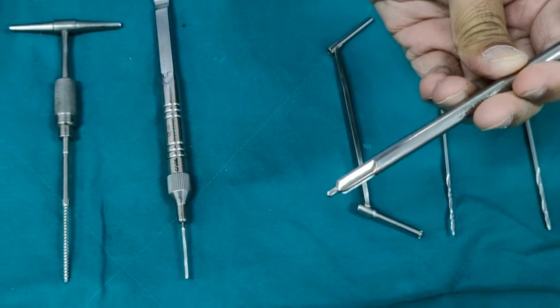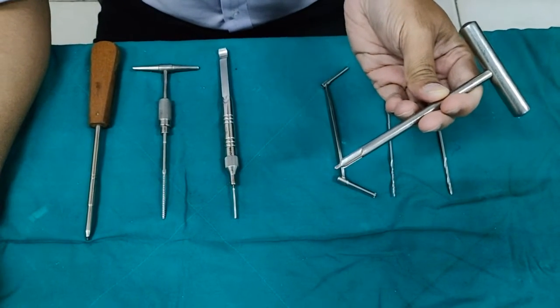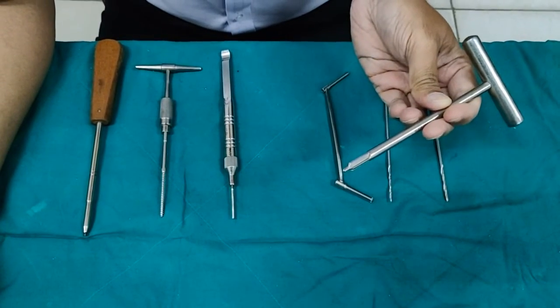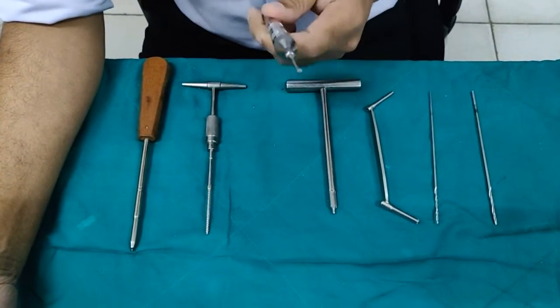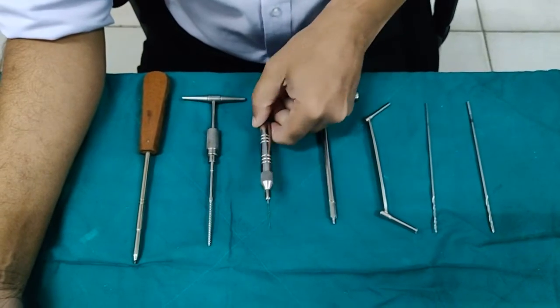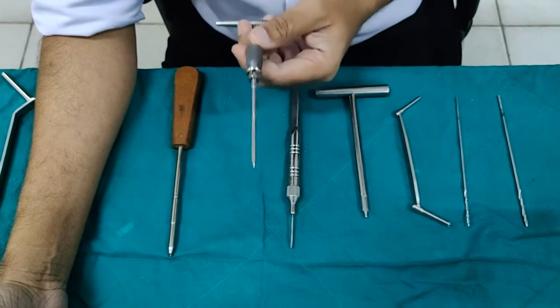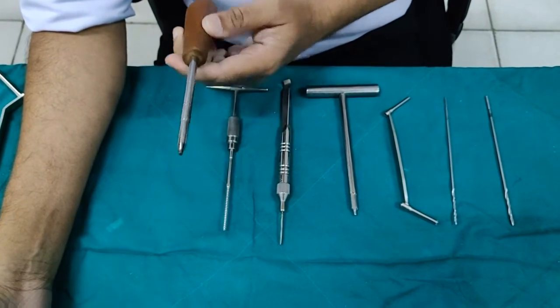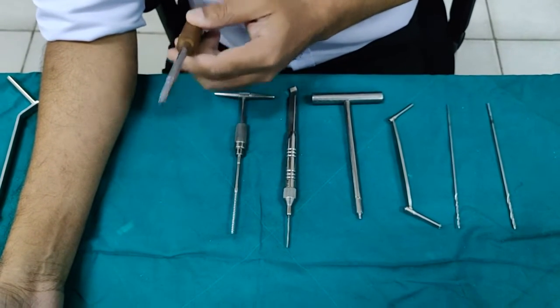The countersink is especially important if you are using a neutralization plate on top, otherwise the plate will not seat on the bone. Once you have done the countersink, your next step is to measure the depth of the screw using a depth gauge. Then you use the tap — if you are using small fragment you are going to use a 3.5mm tap. Then you will require a hexagonal screwdriver for putting your lag screw.